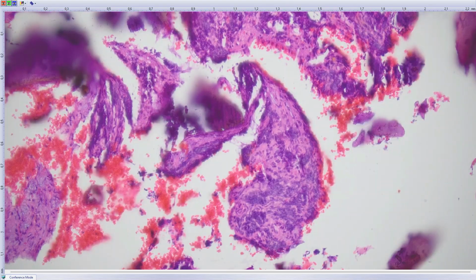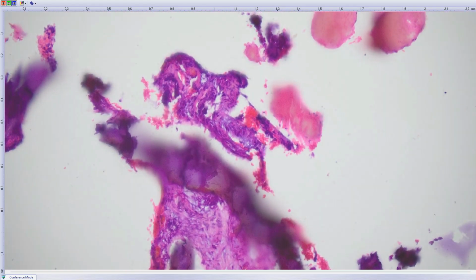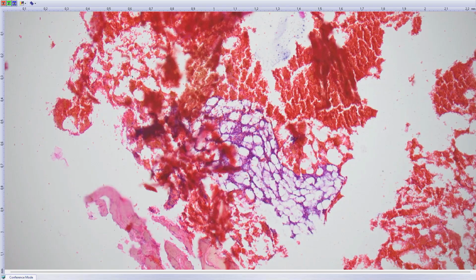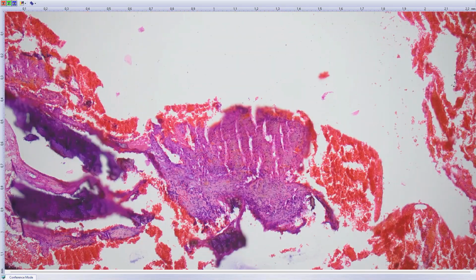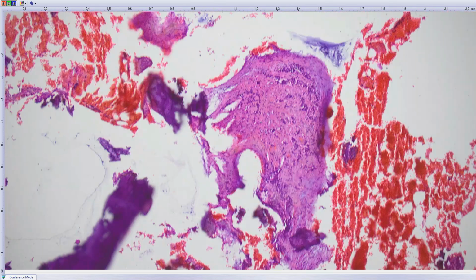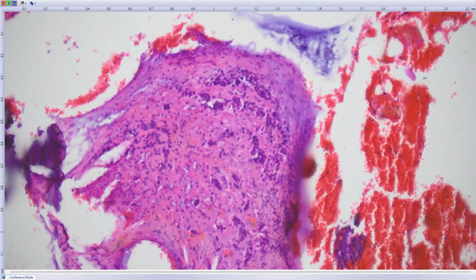But it's a bone lesion, young patient, so you should think of small round cell tumors, and it's uniform small round cell morphology. Hematolymphoid markers are negative, so definitely you should think of Ewing. Because the morphology is so uniform, it's kind of hard to tell for sure, but they basically look like perfect copies of each other, at least in the areas where it's not crushed.